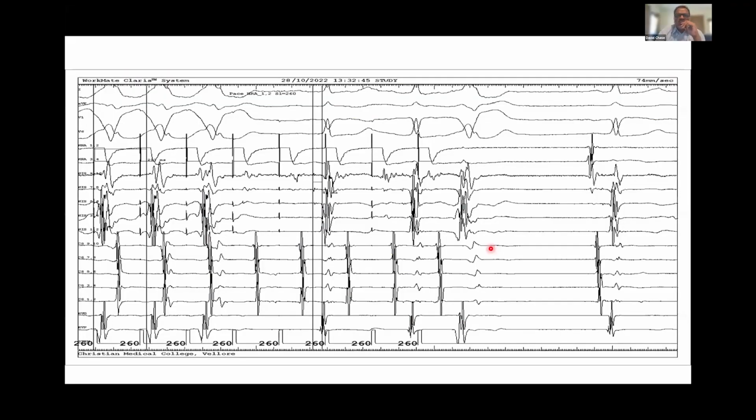I'll use this as my final slide just to quickly say that if somebody has got atrial pacing continuously happening, such as I've shown you in the first slide, I've shown only half of this to start with, where I showed that atrial pacing has resulted in ventricular pre-excitation, and the fourth beat, an atrial paced event, has not resulted in a ventricular event.